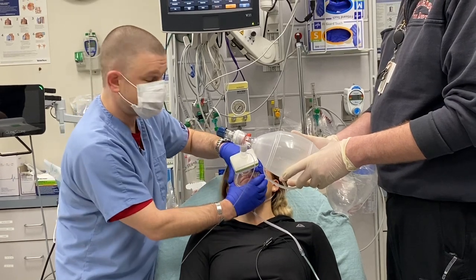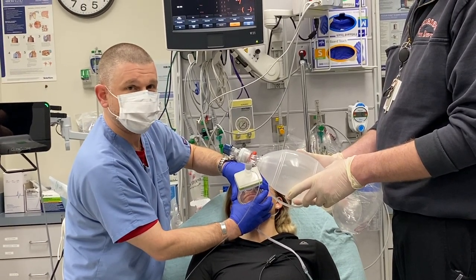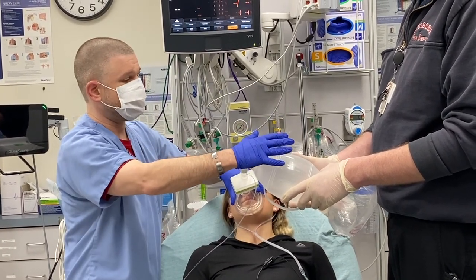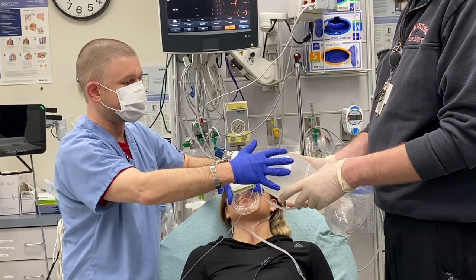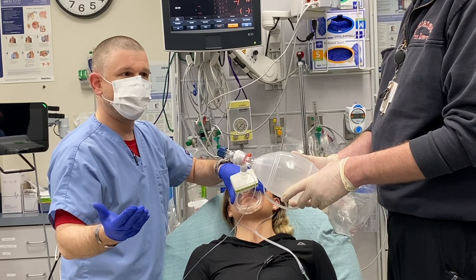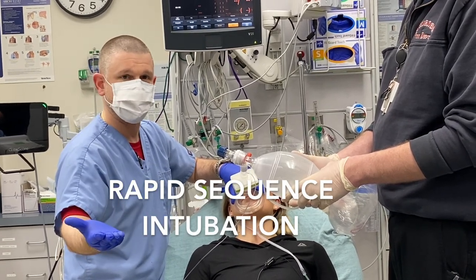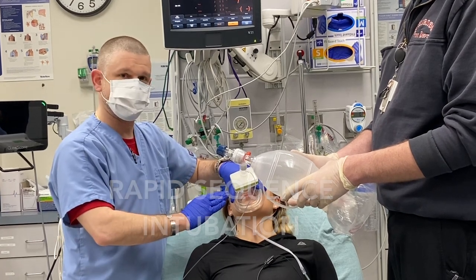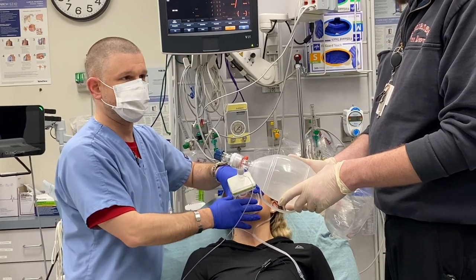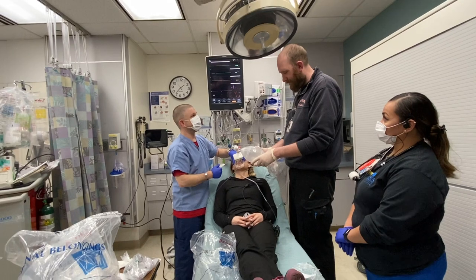So the seal, a good two-handed seal, keeping the airway open, however you need to do it, depending on the patient's body habitus. And the respiratory therapist can hold this unit like this until we go into the second step of the procedure, and that is to sedate and paralyze the patient and discontinue this, and that will be in our second video. Is there anything you want to add from a nursing standpoint? No. Okay. Is there anything you want to add from a respiratory therapist standpoint?